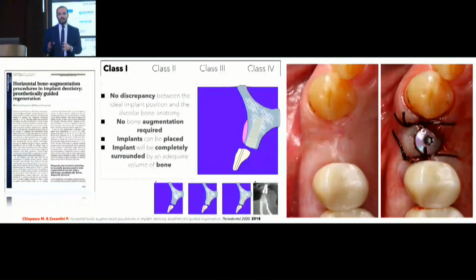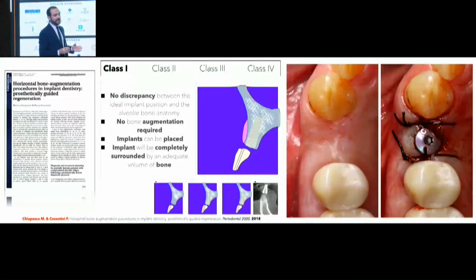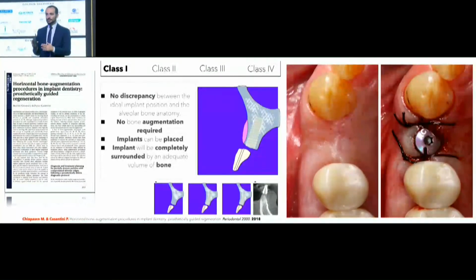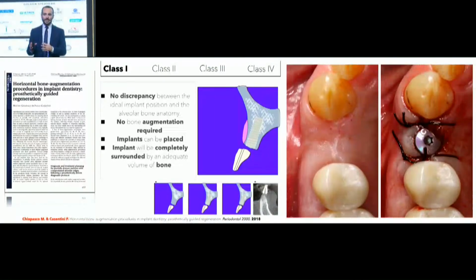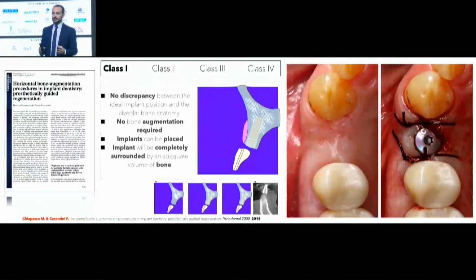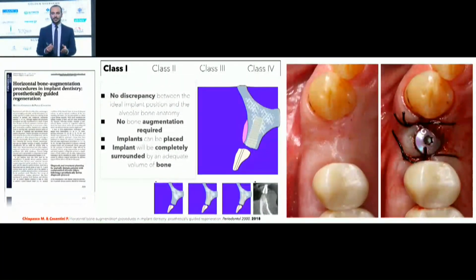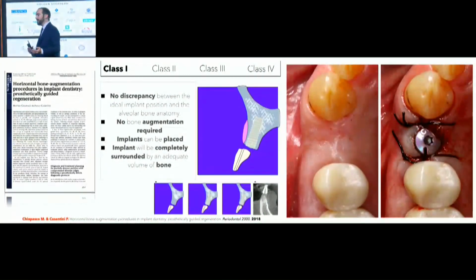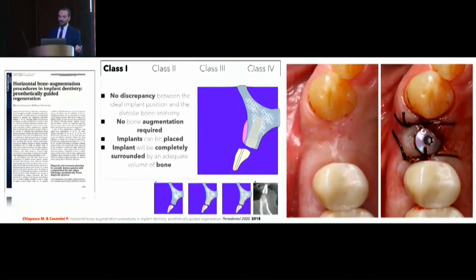the implant. Once again, very, very critical. We are talking about implant placement in the ideal 3-dimensional position. So we have sufficient hard tissue structure, we have sufficient bone for the placement of dental implants. However, we have a deficiency on the buccal side. We have a slight deficiency that sometimes we may need to correct through either soft tissue grafting or bone grafting procedures.